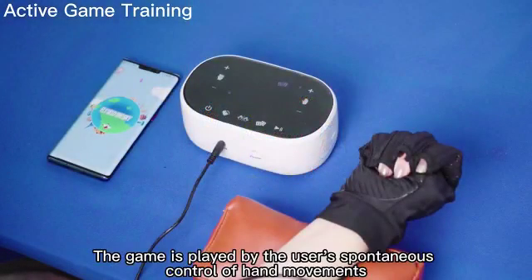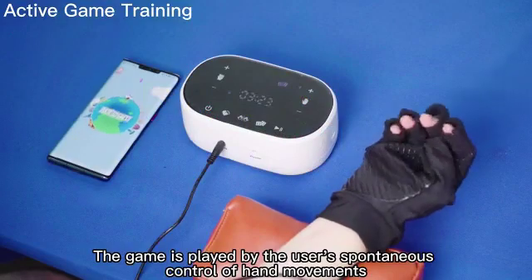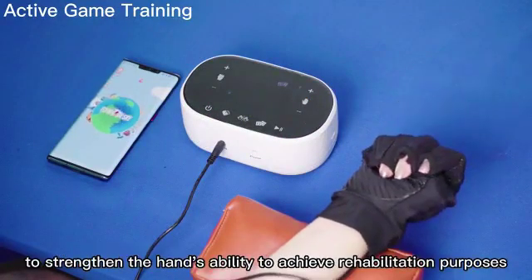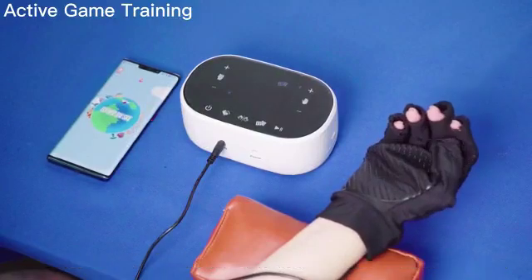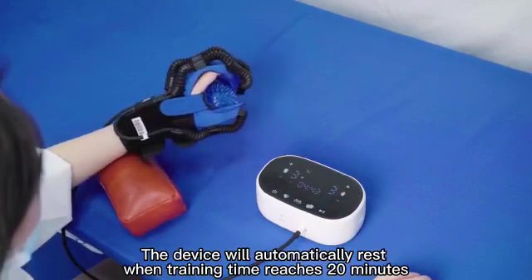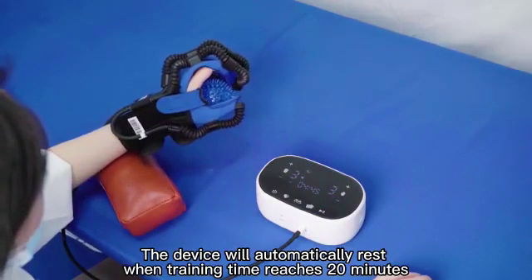The game is played by the user's spontaneous control of hand movements to strengthen the hand's ability to achieve rehabilitation purposes. The device will automatically rest when training time reaches 20 minutes.